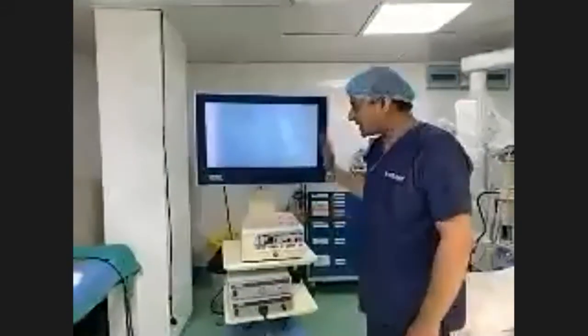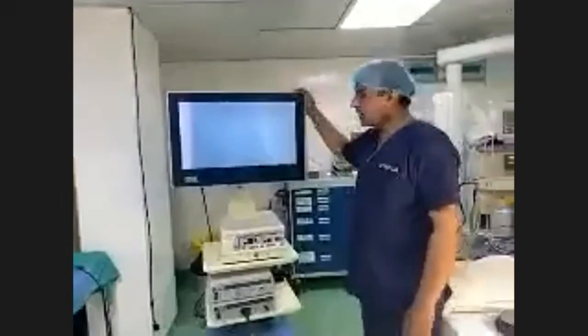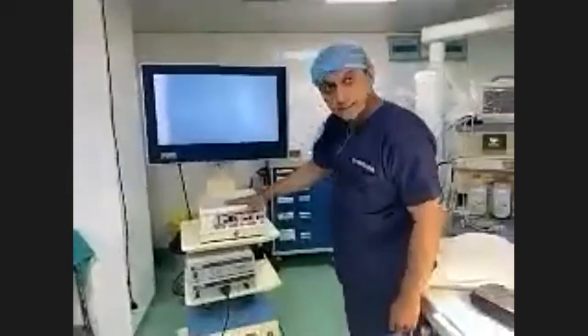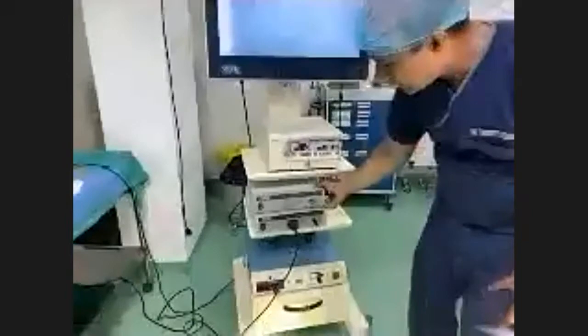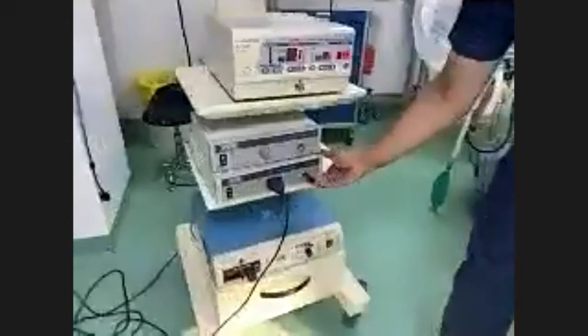So this is a laparoscopic tower, or laparoscopic stack. Here you can see this is the screen or the monitor. Here you can see the insufflator. This is the light source, and this is the camera CCU, or the camera unit.